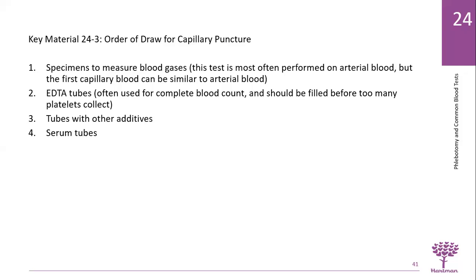You're going to see other videos about the order of draw for capillary punctures versus the order of draw for serum venipunctures. So one is coming through your vein and the other is coming through capillary. There's a different order of what tube you fill first or second and third.